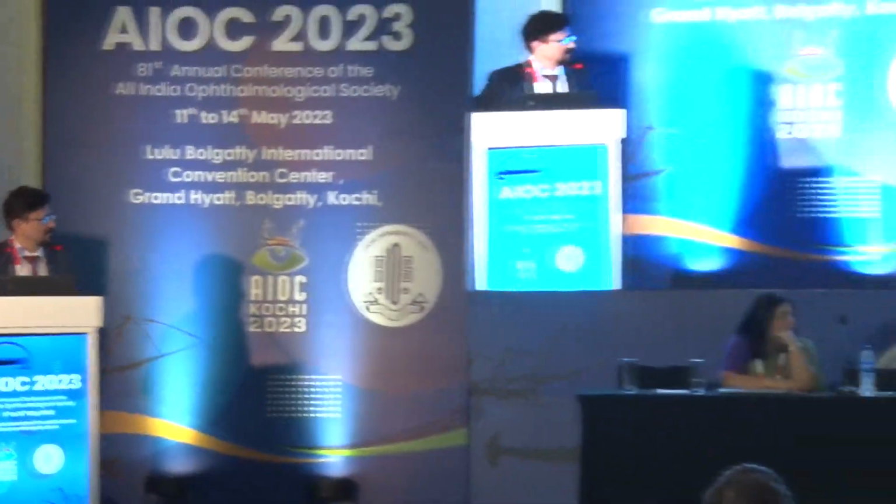And as far as EDOF IOLs are concerned, again in them also angle alpha is of importance, because unless the EDOF is aspheric neutral, the asphericity itself leads to a lot of induction of aberration once there is a decentration. Higher is the asphericity, higher is the induction of more secondary aberrations. So as far as EDOF IOLs are concerned, the angle alpha holds true unless it's an aspheric neutral lens.